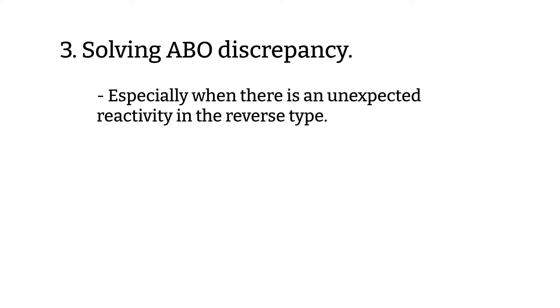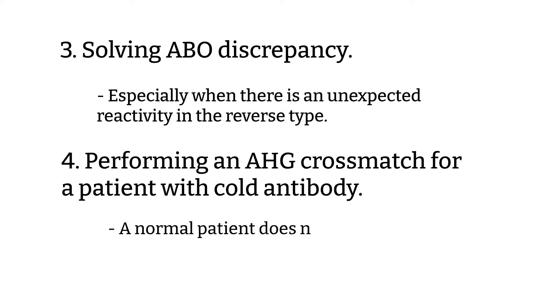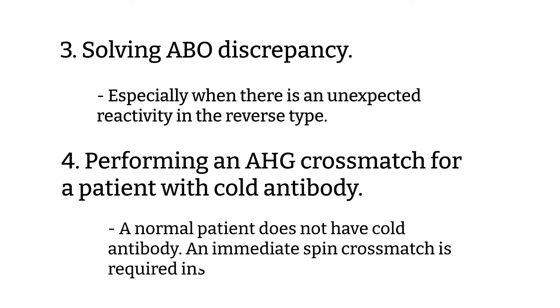Fourth, the immediate spin crossmatch when a cold antibody has been identified. When the cold antibody interferes with the immediate spin crossmatch, a pre-warm crossmatch can be used to help find a compatible unit. Unexpected reactions in an immediate spin crossmatch could be due to cold antibody, so you can repeat the crossmatch using pre-warm technique, warming the patient serum and donor cells separately prior to testing.